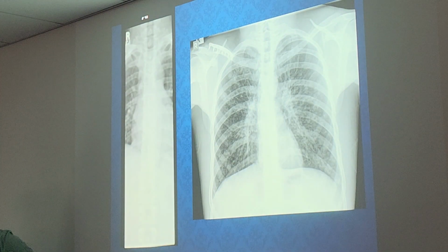These are some examples. What position is this? T-spine. Thoracic spine. You see that the right marker is placed, correct? Away from anatomy. We have a chest. We have the right marker. Of course, you can use the left, but typically they say to use the right marker.